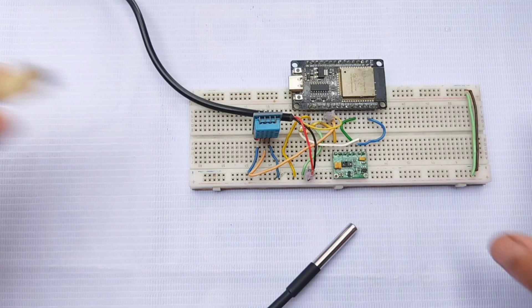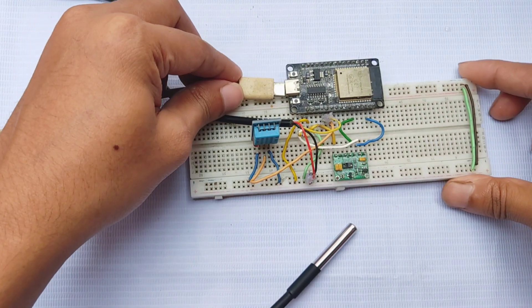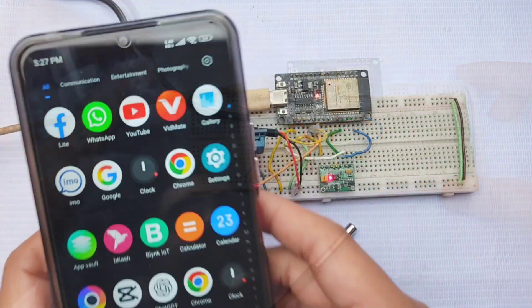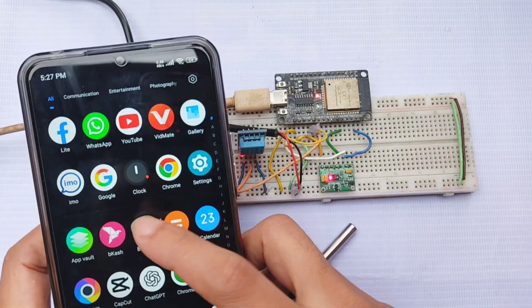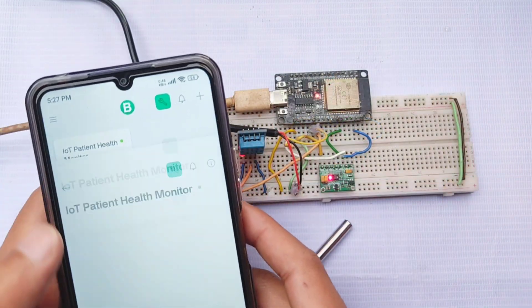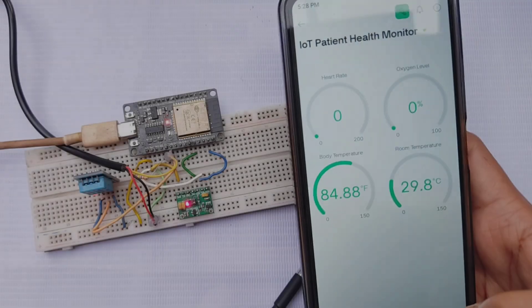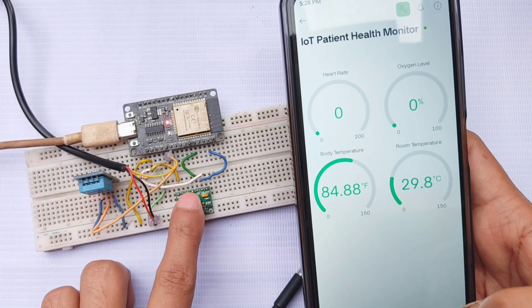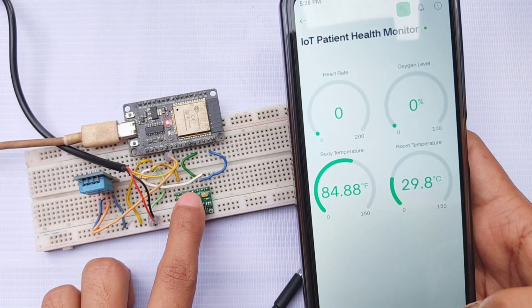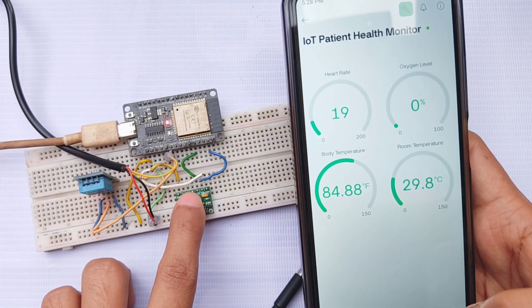Now let's see the final result. Keep your ESP32 within close range of your Wi-Fi network. Open the Blink mobile app to start monitoring the parameters. Place your finger gently on the pulse oximeter sensor to view your heart rate and oxygen level.